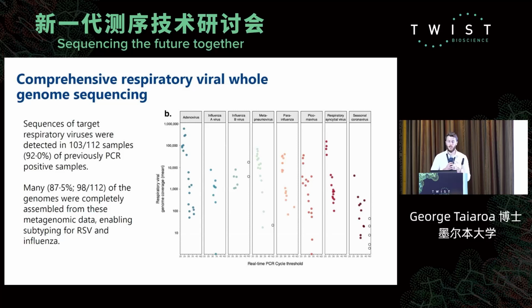level. We can then use that to say subtype things like influenza or RSV, which is important for vaccine selection or vaccine design. We have a number of companies that are working with us looking at would their new vaccines be able to cover the kind of diversity of RSV or flus that are out there based on this type of information. So really promising.